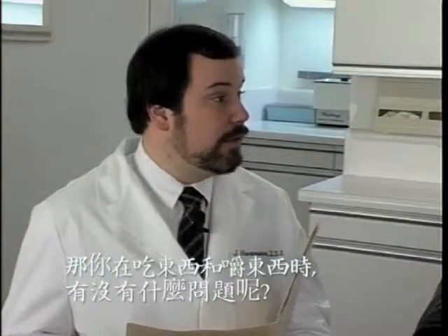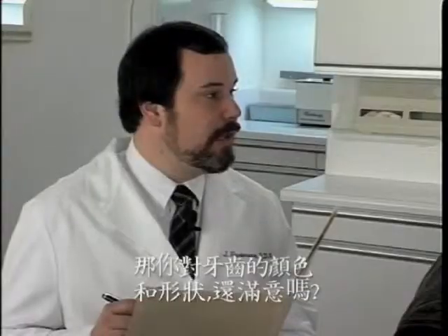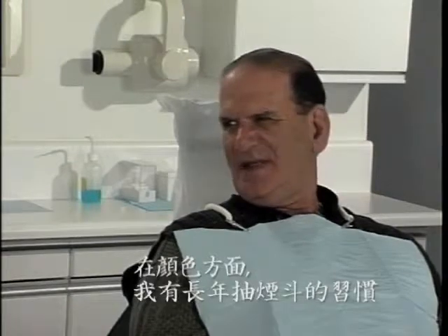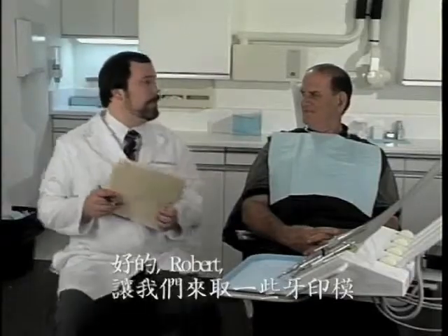Do you have any problems eating or chewing? I have problems with hard things like apple, or biting corn on the cob, or even chewing steak sometimes. Are you happy with the color and shape of your teeth? I don't know anything about shape, but in regards to color, I smoked a pipe for many, many years, and the nicotine's made the teeth darker, so I like to have them lighter if possible. Okay, Robert, let's take some impressions.